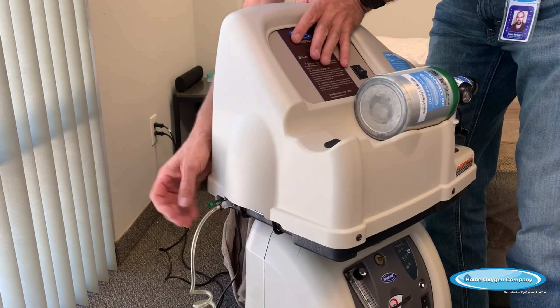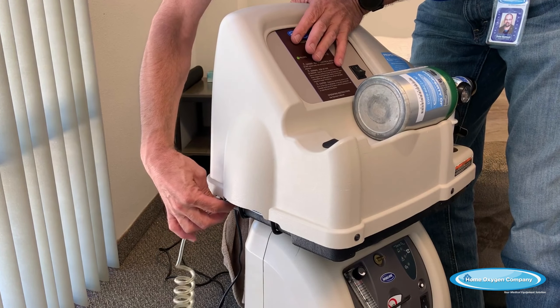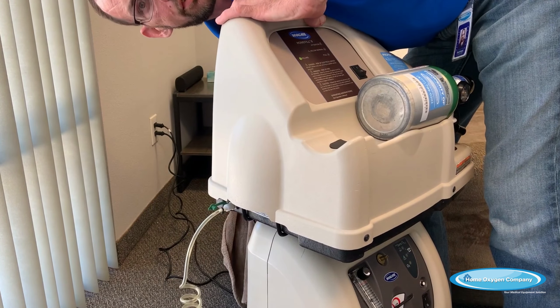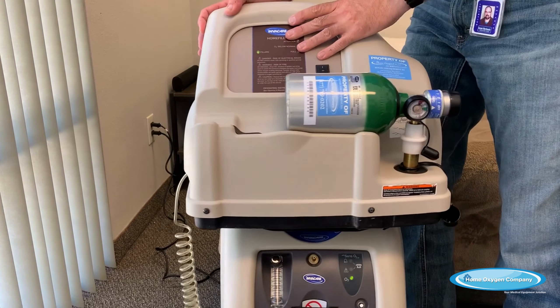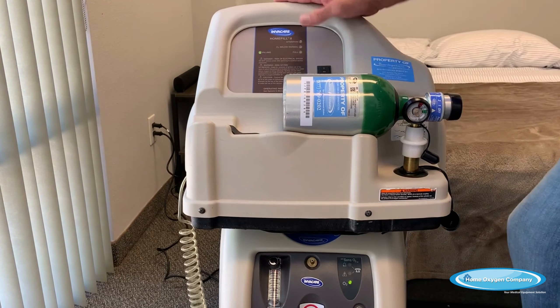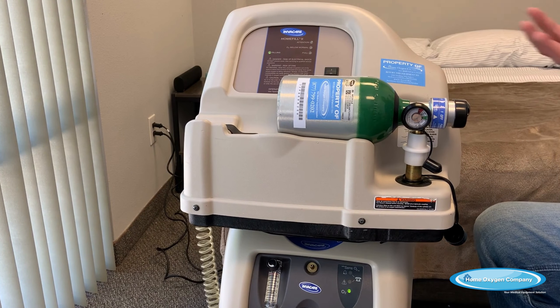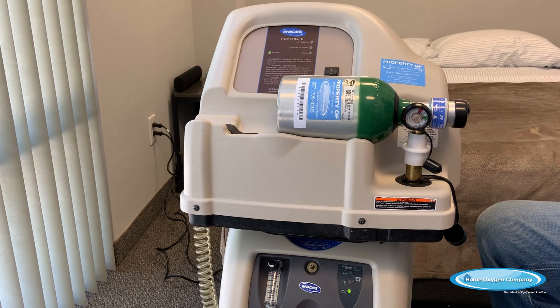There are two plugs. It plugs into the side of the home fill here and plugs into the bottom of the concentrator down here. Unplug that and you're able to take this unit with you, find a place to plug in and set up, and you have all your oxygen needs.